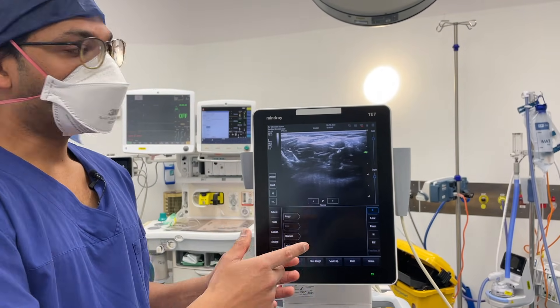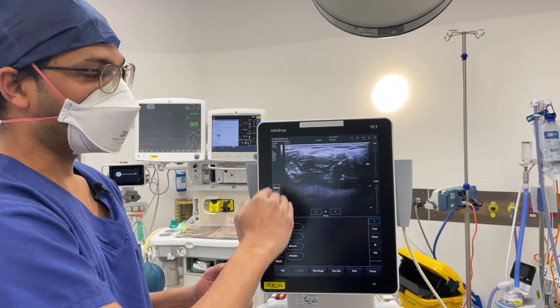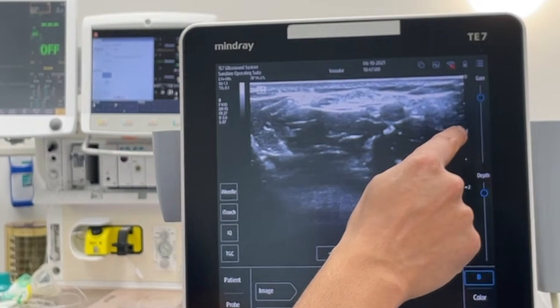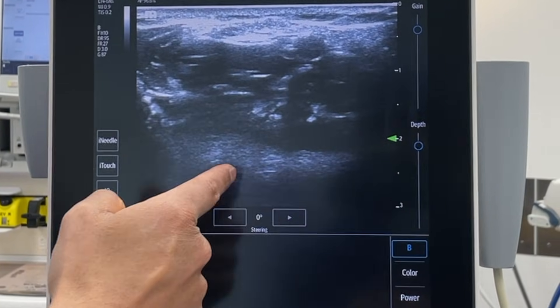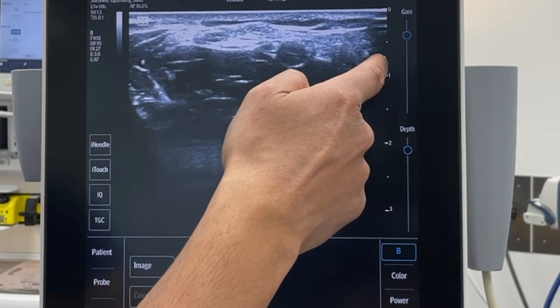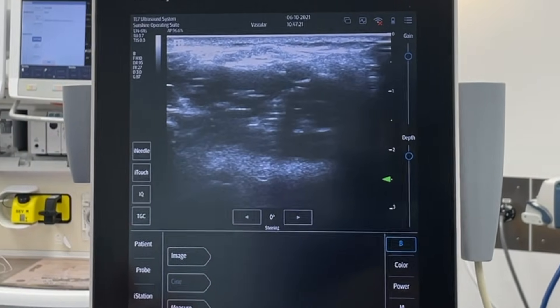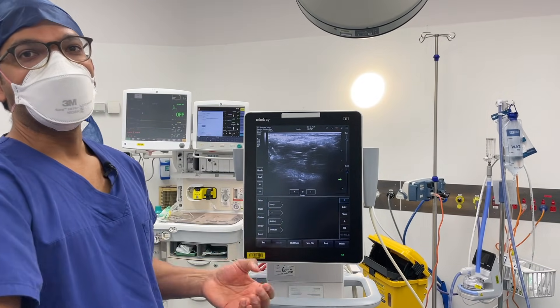After depth comes frequency, which is already preset. Some machines let you alter the frequency manually — just know that higher frequency gives better resolution, while lower frequency gives more penetration for deeper structures. You may want to play around with your settings to get the best view possible. F for focus is the little arrow on screen — you move it to the structure of interest. If I want to cannulate something superficial, I move it up; for something deeper, I move it down for better image quality.